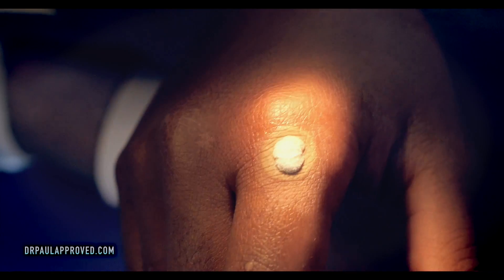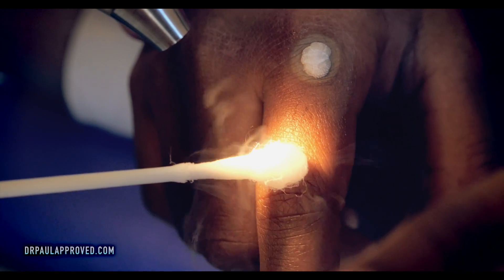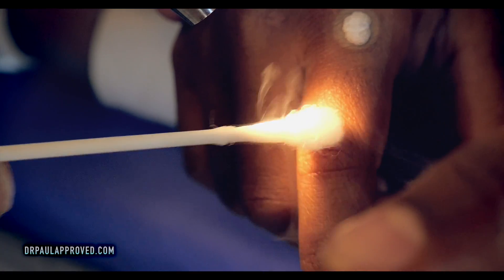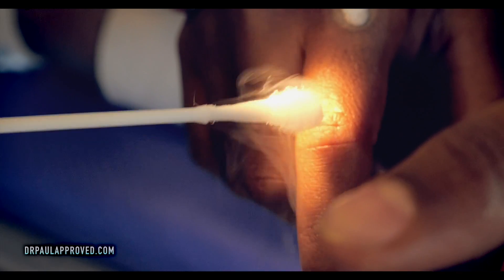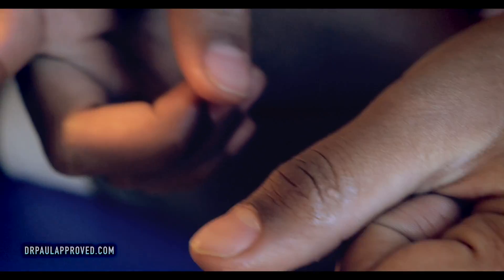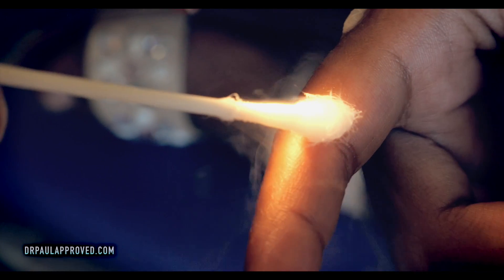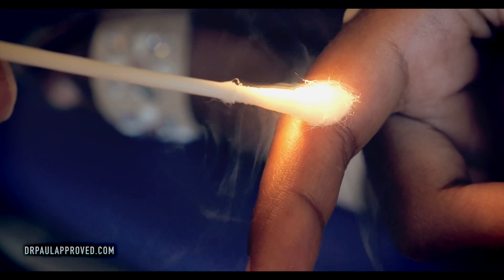And then that allows your body to fight the infection. Warts are actually a viral infection. The little ones — there's one right there. That one is so tiny. It kind of hurts more. Interesting, huh? That that would hurt more. And where's the other little ones? Right there. You're doing so good — you are so brave.